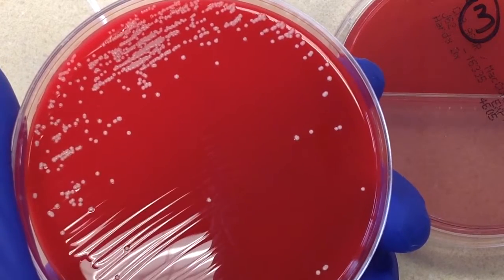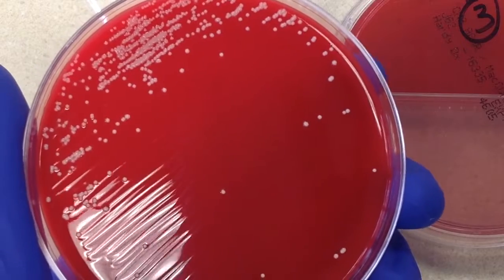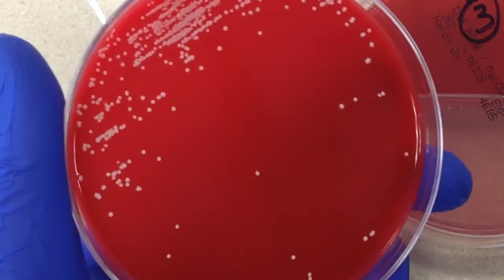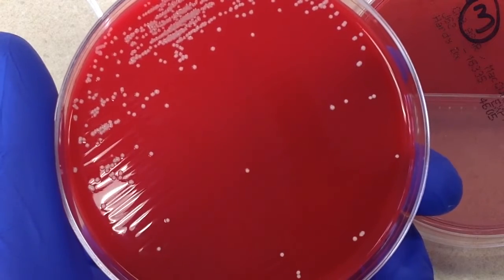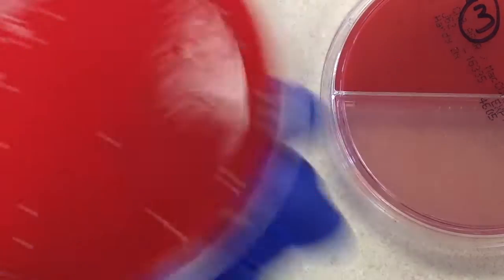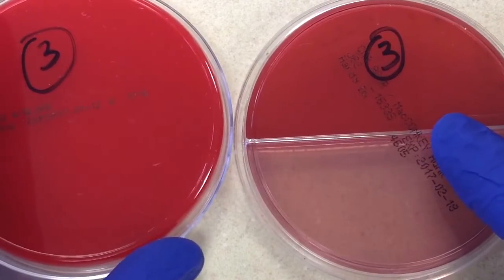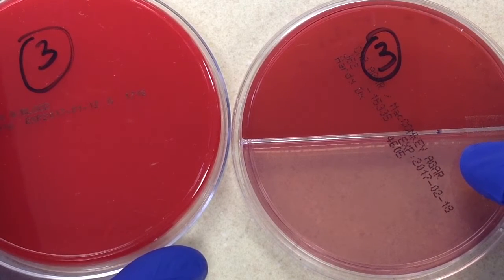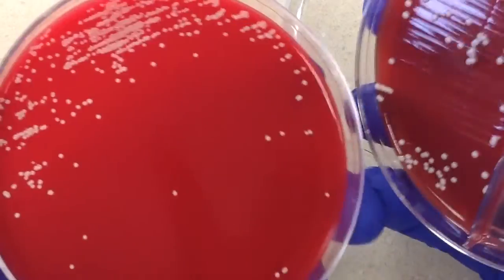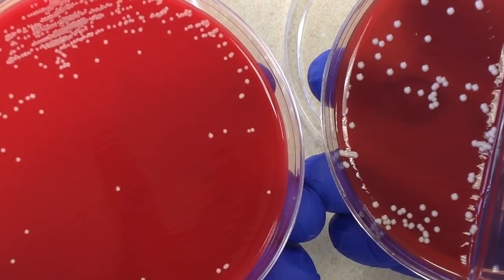Doing our count off the sheep blood plate — the colonies are smaller but again we have greater than 100,000 colonies, so regardless of whether it's a clean catch or catheterized urine we're going to work up this organism. When talking about gram-positive organisms that are pathogens in urine, the three most common are Staph saprophyticus, Enterococcus, and yeast — specifically Candida albicans.